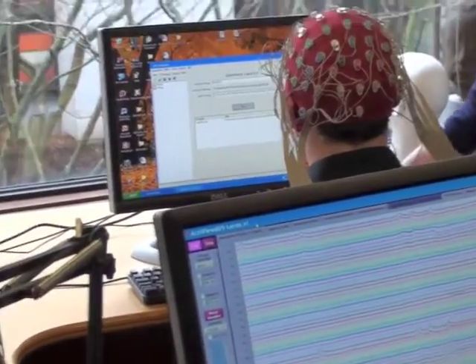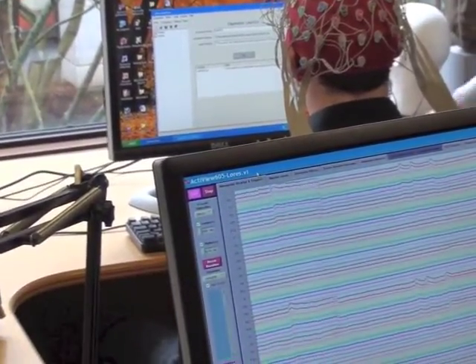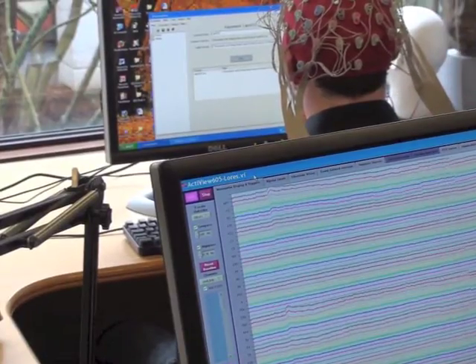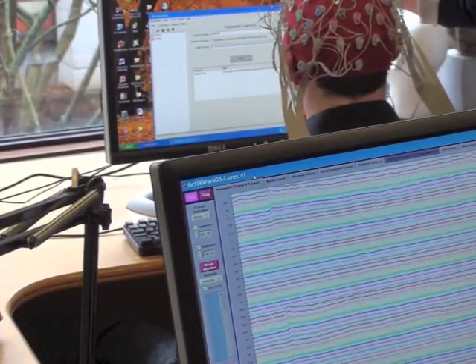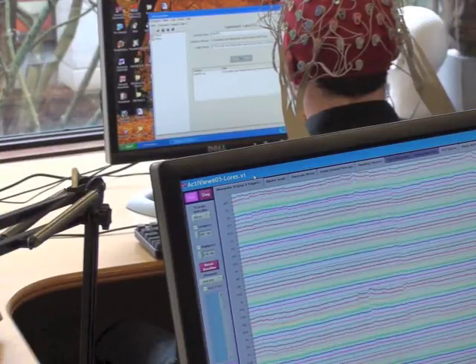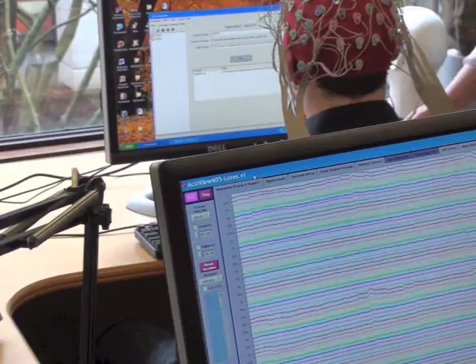Now, what I'm going to do, I'm going to start the presentation program for Bren. I'll obviously have explained the instructions to him. What I like to do as well is, if the participant needs to be a certain distance away from the computer, you can put the keyboard on the lap if you want, because it's easier than having to reach out. It doesn't really matter.